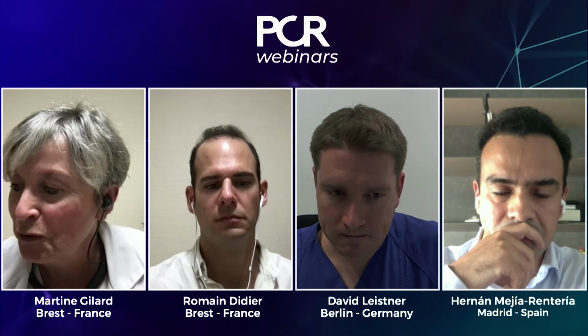Another question from the audience is about the sensitivity and specificity of the QFR versus FFR. Some of them are angry because there is no standardized cutoff. But you told us that there is a standard cutoff, which is 0.8. So what is the sensitivity, specificity of QFR versus FFR? You showed us in your slide, but perhaps you can say it again.